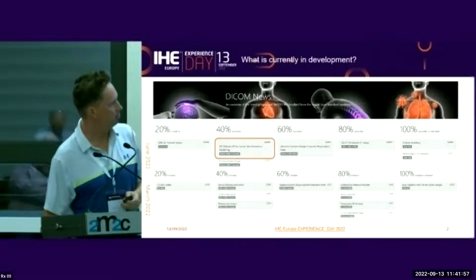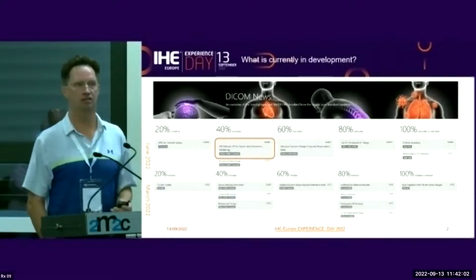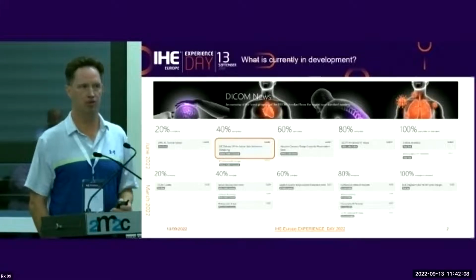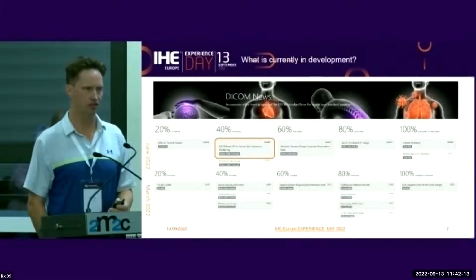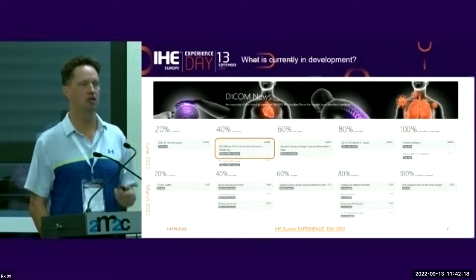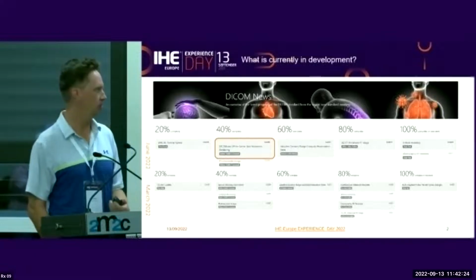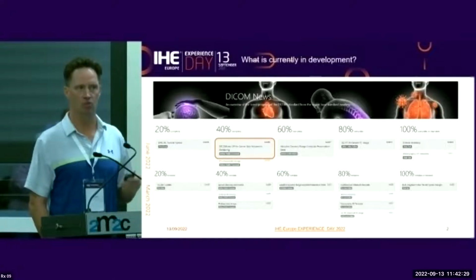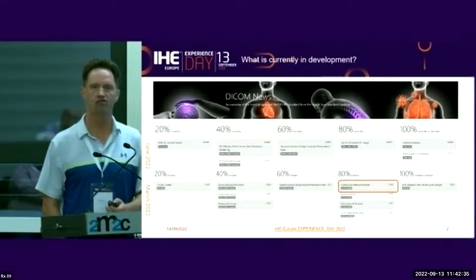And then a couple of highlights on this first slide. One big direction that the DICOM standard is taking right now is to improve the web interface, the DICOM web. So one part here is to have a service where you can, as a client, request to get 3D MIP or MPR renderings out of a DICOM image stack. There are a couple more examples of what is happening within DICOM with the web interface further down in the slide set.